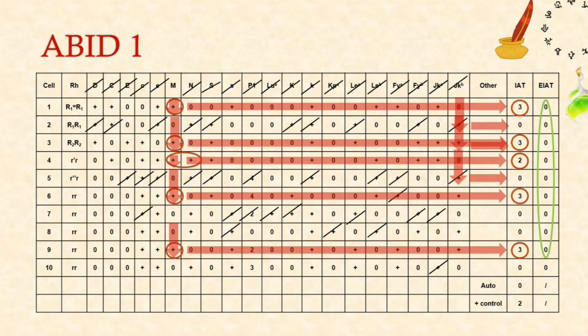And you can, at the top, I would just go, right, I've got 2. I'm really happy with this. If you really wanted, you could go all the way down and cross them all out. It's however you choose to do that. But as long as you're following your BSH guidelines and excluding, you can do single specificity on a homozygous line. Then we've got similar again with the JKB, that's gone.